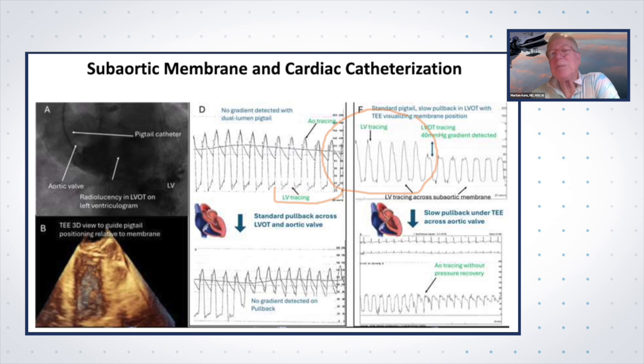And lastly, the shape of this, I guess not intracavitary, the space between the valve and the membrane has this peculiar left ventricular pressure tracing. So if this is above the membrane, and this is below the valve but above the membrane, it should be aortic.